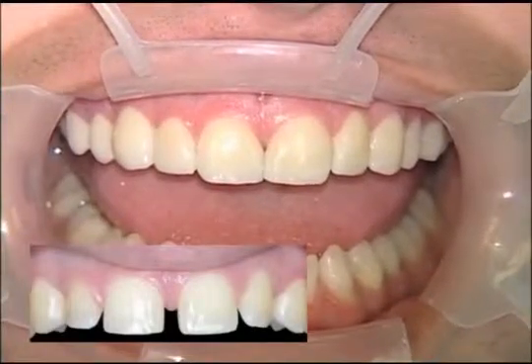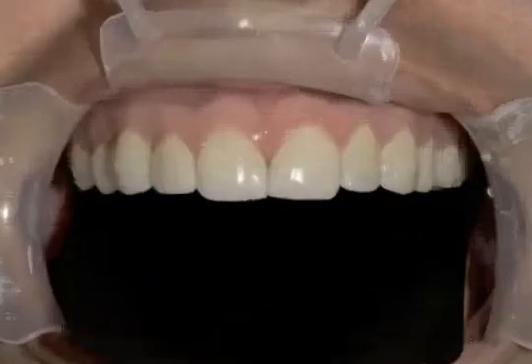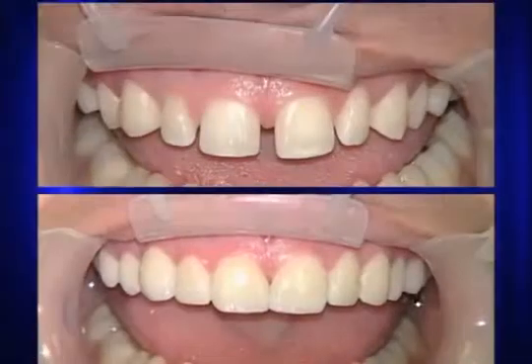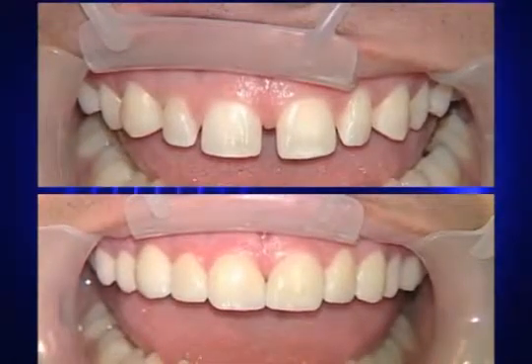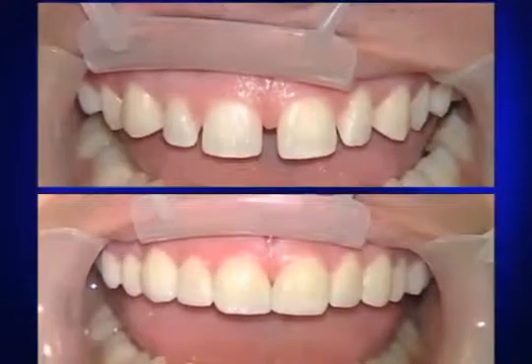You notice we still have a small black triangle at the gingival margin between 8 and 9 in that gingival embrasure. And sometimes with a no-prep case, it's impossible to close a large diastema completely. In fact, that's a really good job that the technician did on this case. If you do want to close that completely, or if that's one of the patient's requirements, I would suggest that you prep 8 and 9 and drop the margin slightly subgingival. Use a soft tissue model and your technician should be able to close it completely.